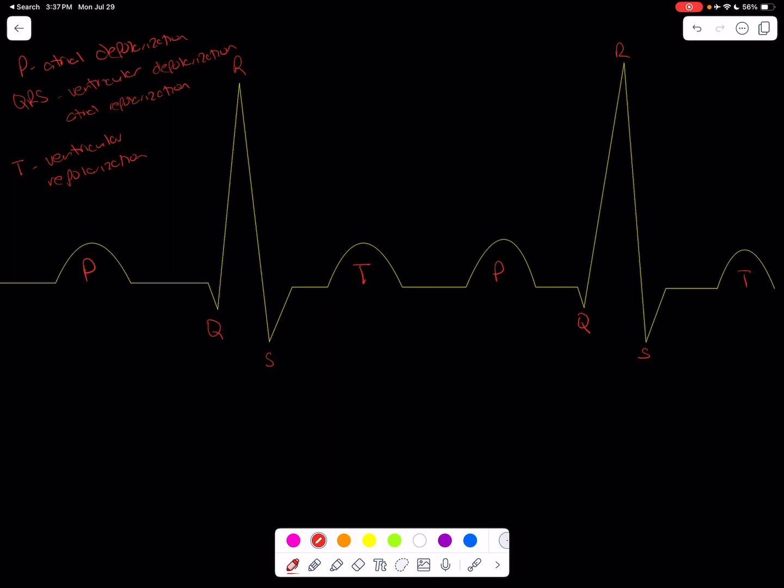Okay, so now let's talk about two segments. All right, and so we'll do the segments in white here. Okay, so the PR segment goes from here all the way to the beginning of QRS. So right here is PR. Okay, and so with PR, this is the time, I hate that I do that all the time. So PR is just the time the AV node holds the signal.